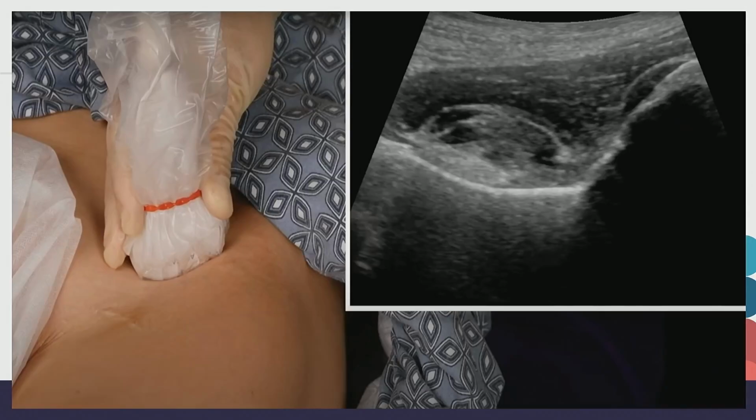And this is what the ultrasound image would look like, where you have the AIIS over here on the lateral side, the iliopubic eminence on the medial side, the psoas tendon, and the iliacus muscle here. And when we do the live scanning, we'll show you just superficially, you would see the femoral artery and the nerve up there as well. And as the needle comes in this way, your target would be right in this area to bathe this trough to give you that nice spread of local anesthetic along that pelvic brim.